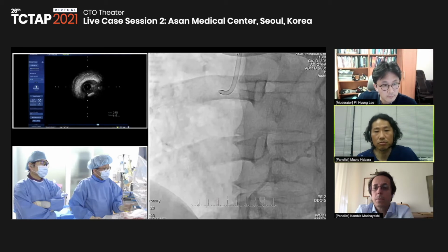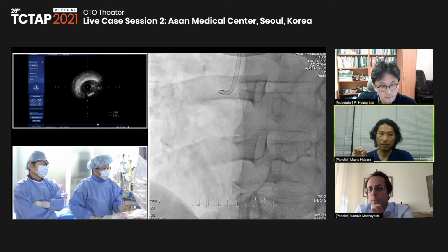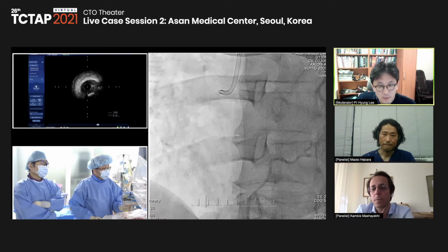So to make a correct puncture, IVUS-guided puncture is very important. So we need 8 French, and to make strong backup, we use a double lumen catheter. Okay, so you want to do a real-time IVUS evaluation of the puncture, right?